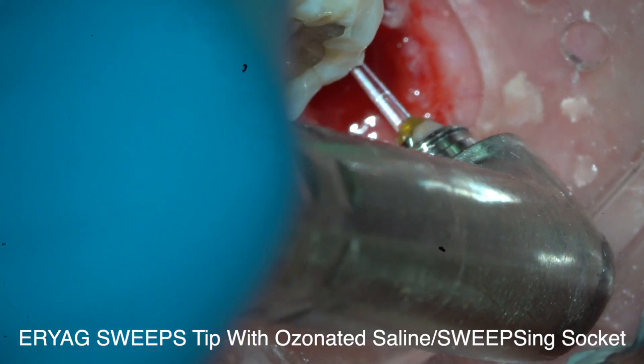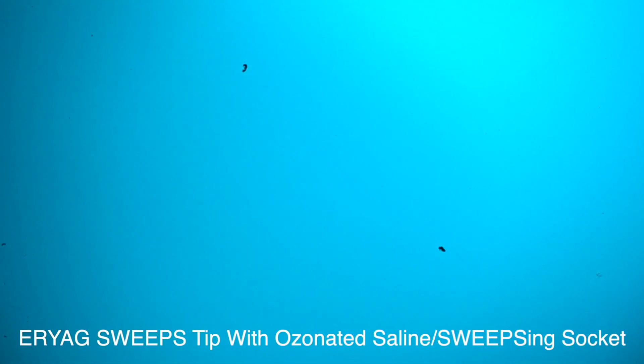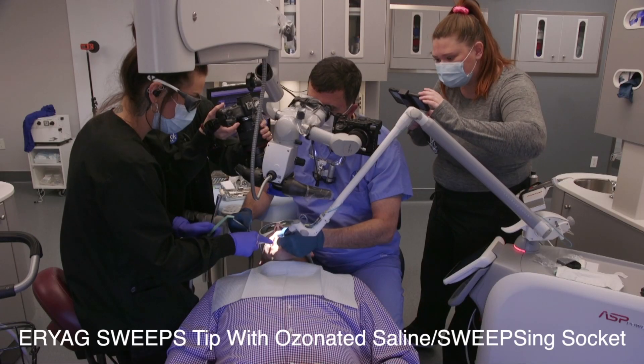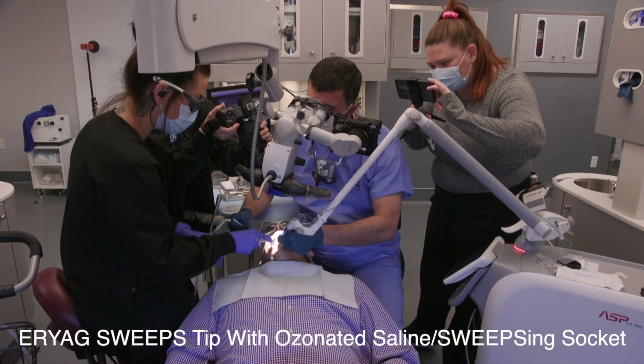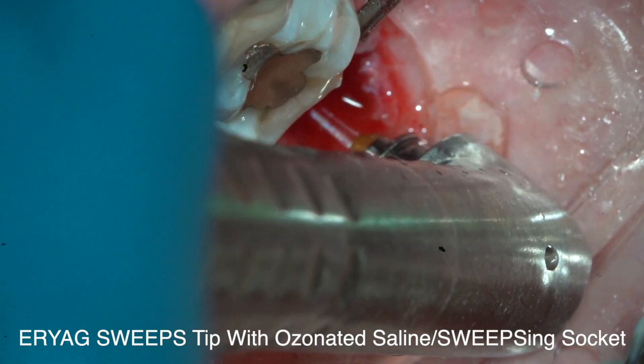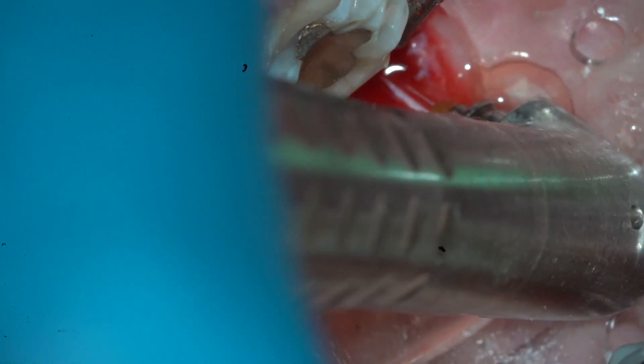Let's go. Bright red's a good thing. Blood carries oxygen, right? So the ozone is like this ultimate oxygen carrier — blood is life, basically. More oxygen is good for you. Something heals faster.